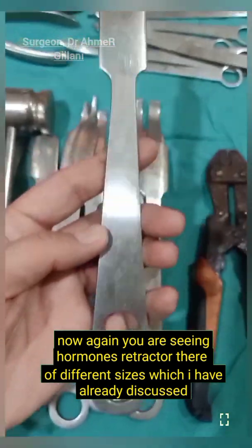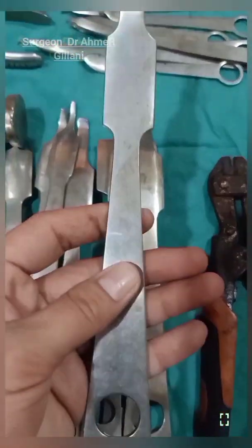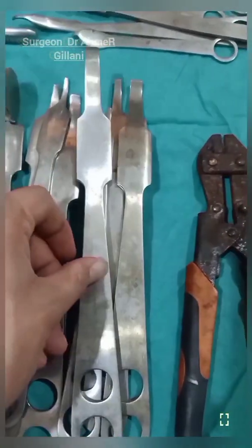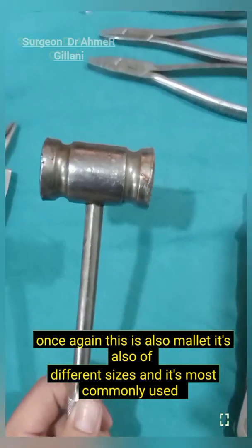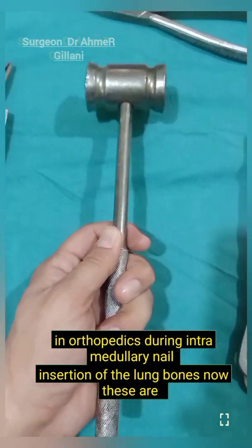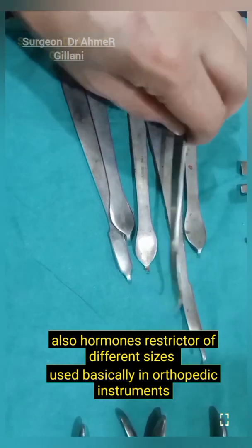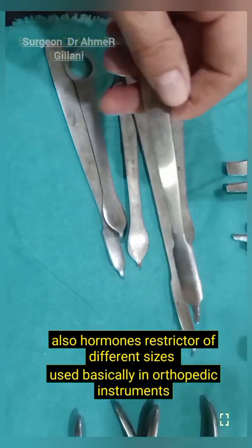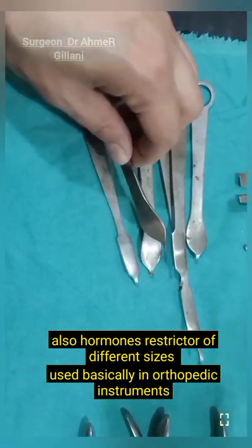Once again you are seeing Homans retractors of different sizes, which I have already discussed. Once again this is also the mallet. It is available in different sizes and is most commonly used in orthopedics during intramedullary nail insertion of the long bones. These Homans retractors of different sizes are used basically in orthopedic procedures.